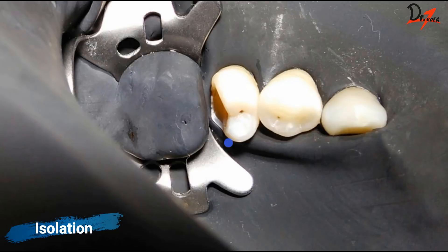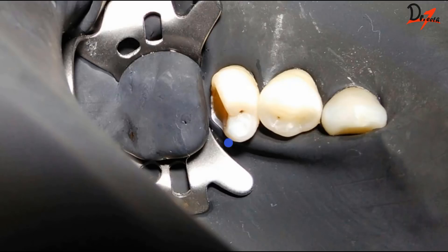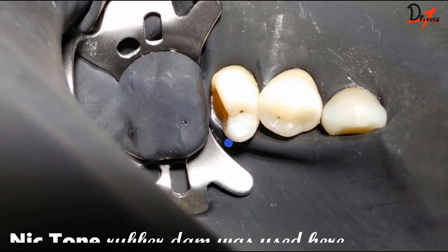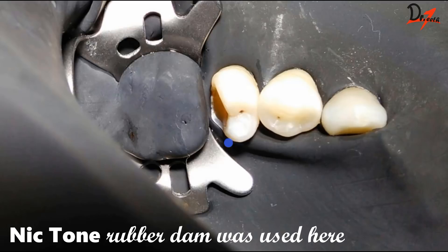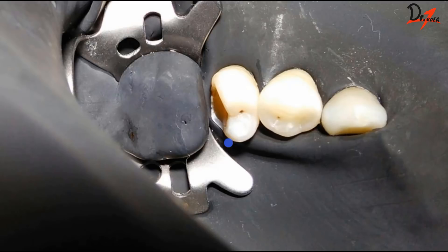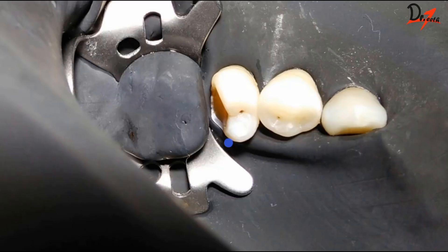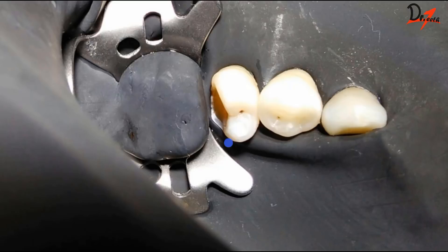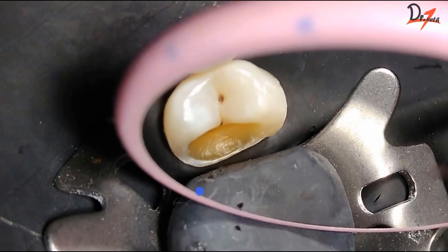The next step is rubber dam isolation. The rubber sheet is available in three options — heavy, medium, and thin — and we are using heavy here because it has stronger recoil. The color chosen is black, as it provides better contrast for aesthetic documentation. The black background gives very good contrast in images, as you can see here.